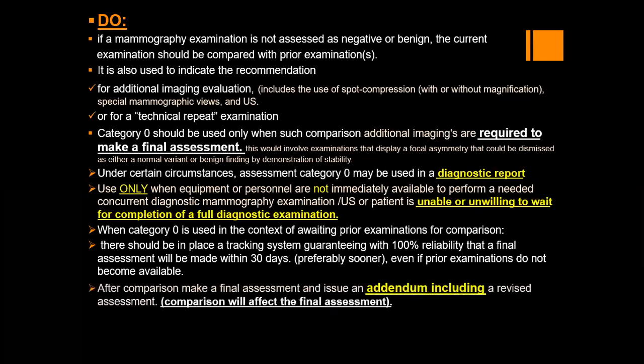After comparison, make a final assessment and issue an addendum including the revised assessment, if the comparison will affect the final assessment.